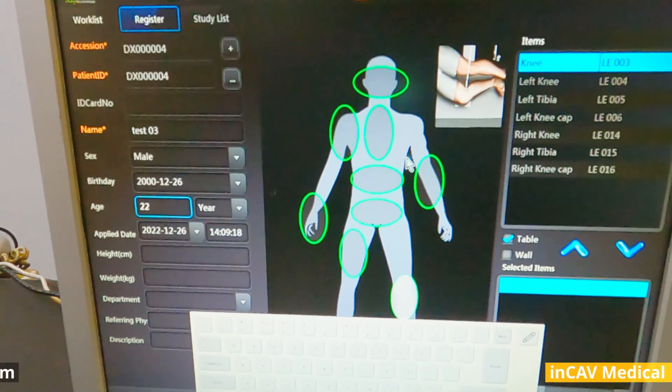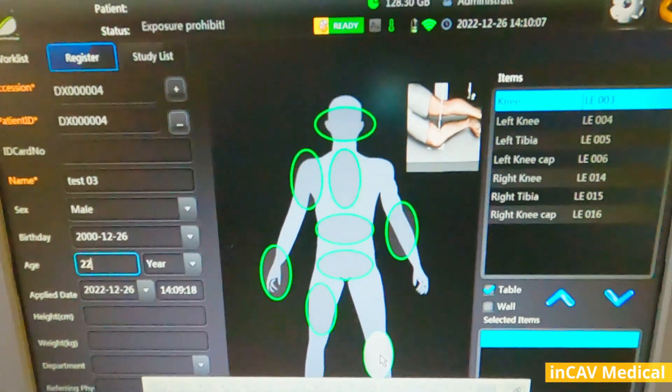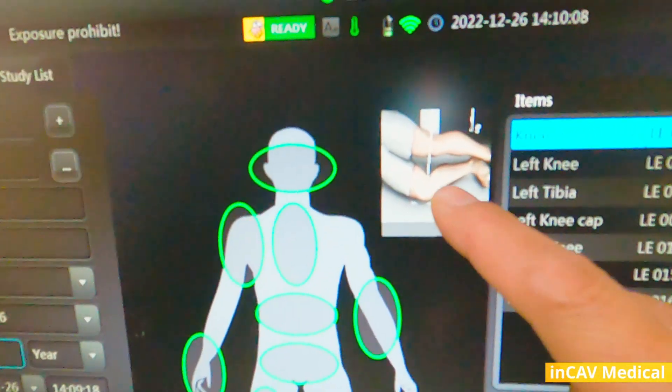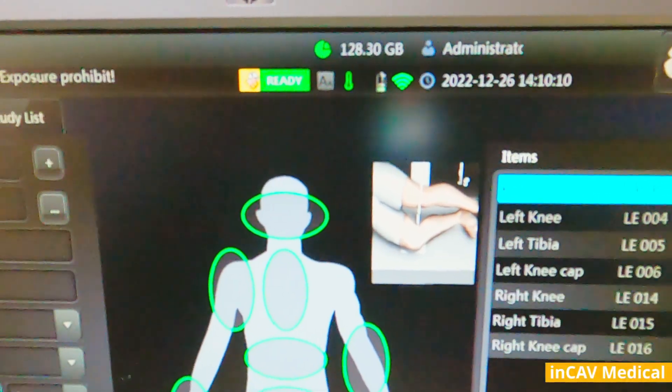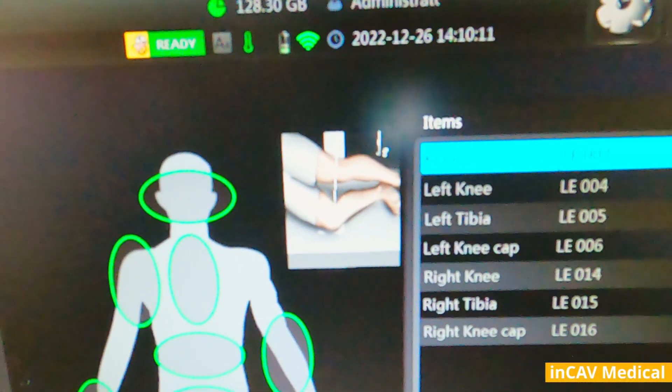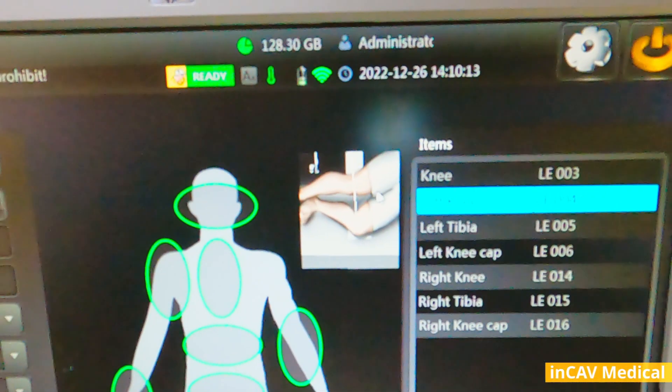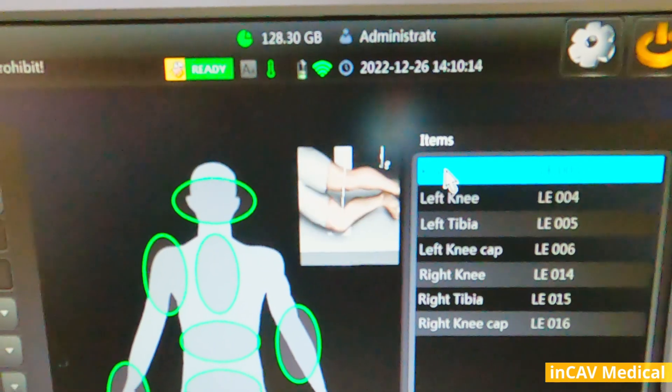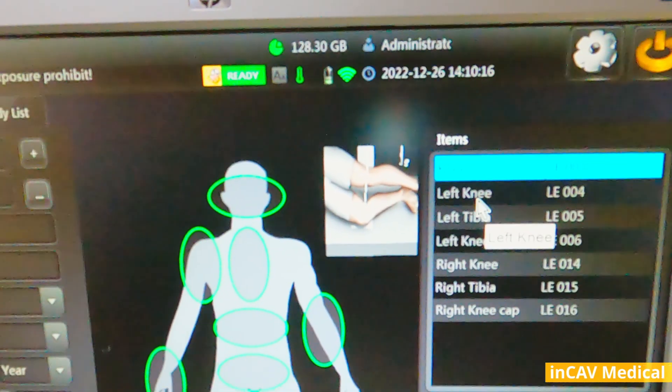Notice that when you click on different areas, it shows a picture indicating how to position the patient. This is very helpful for any X-ray tech to avoid mistakes, also for training.